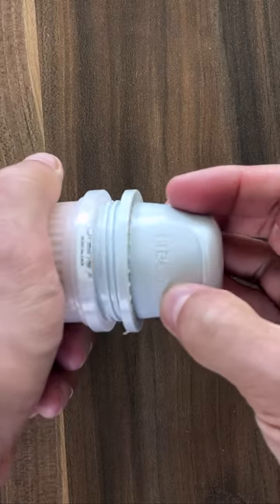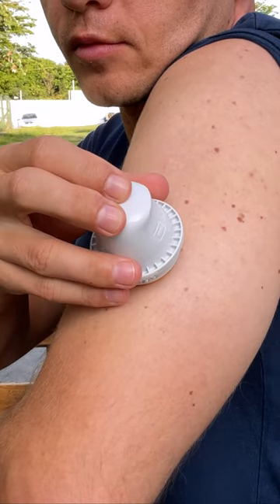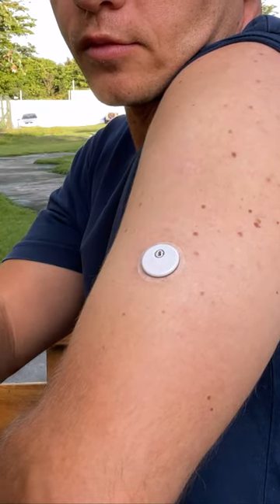With the Libre3, you simply unscrew the lid, place the applicator over the site, push the top of the applicator down to apply the sensor, and then gently pull the applicator away.